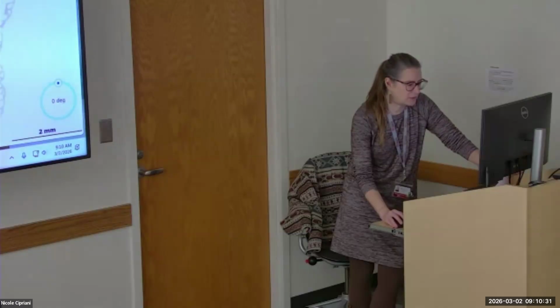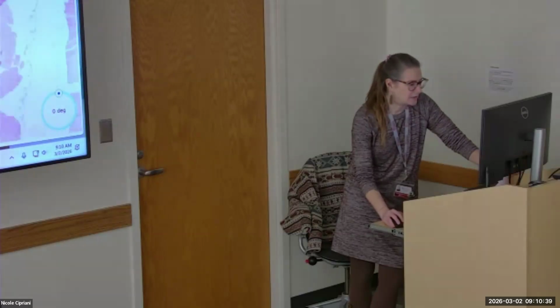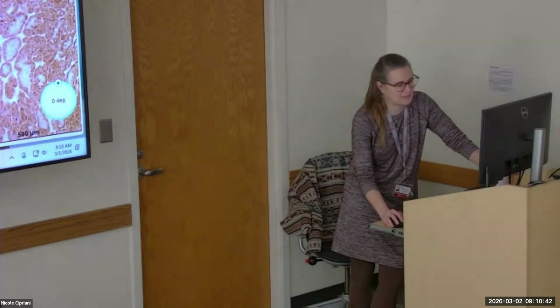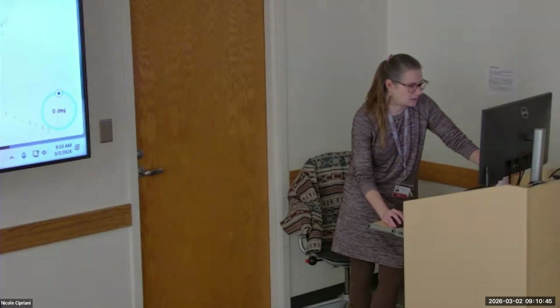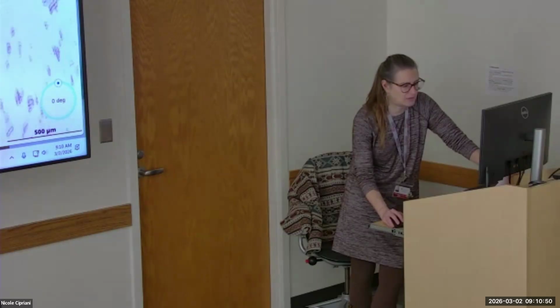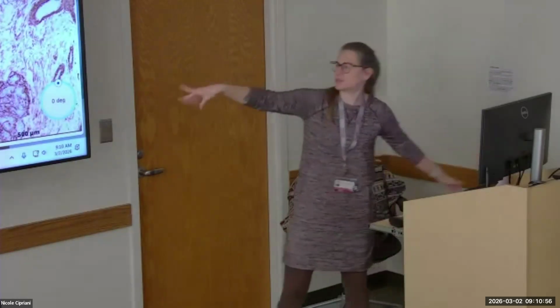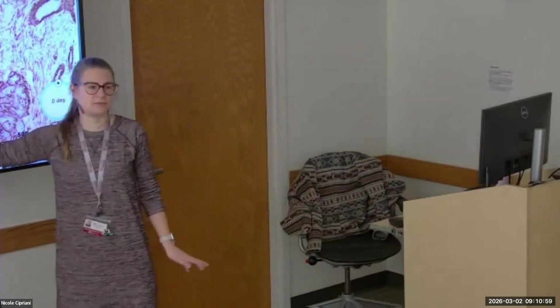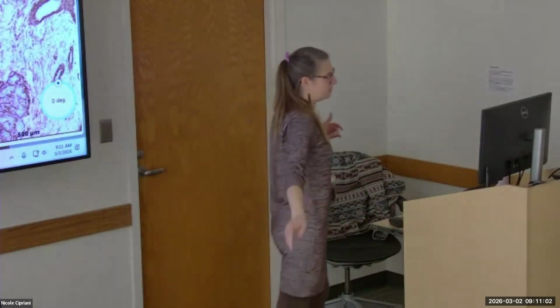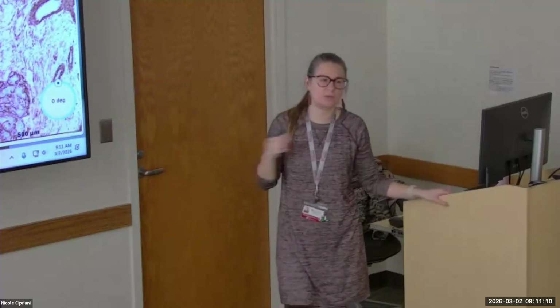So you can walk yourself through the immunostains for our favorites, right? P40, CD117, S100 kind of again stains a lot. This is like a myogenic marker. There we go. I think this is SMA, these are blood vessels, right? So just to prove that these actually are myoepithelial differentiation. Anyway, so this is epithelial-myoepithelial carcinoma. I've got so many more salivary tumors, we could spend 5 hours on them. But these are the ones you're probably going to see.